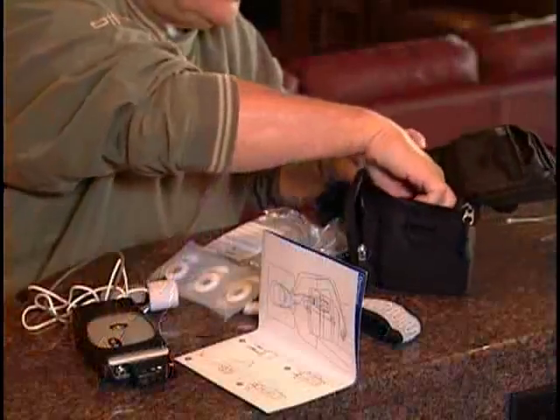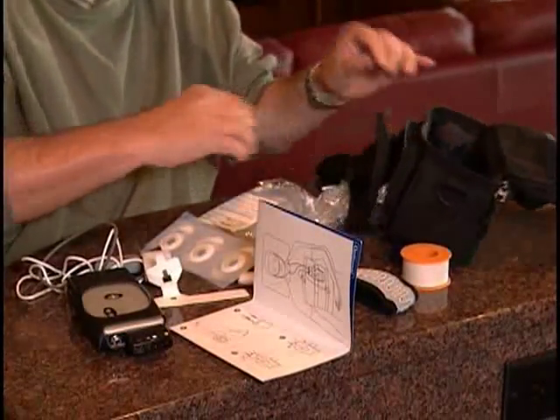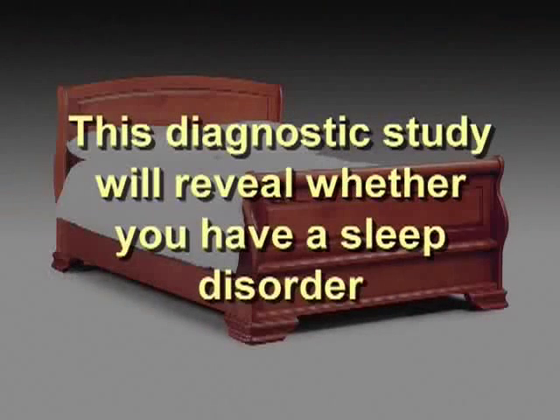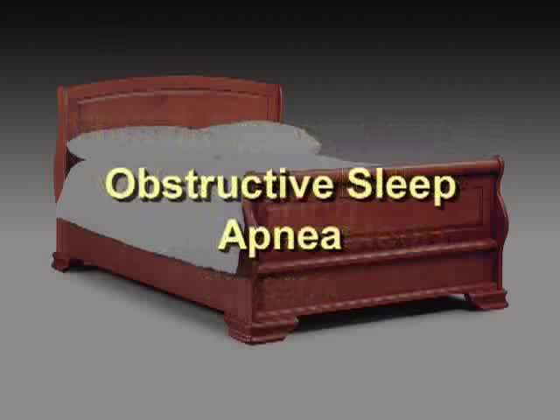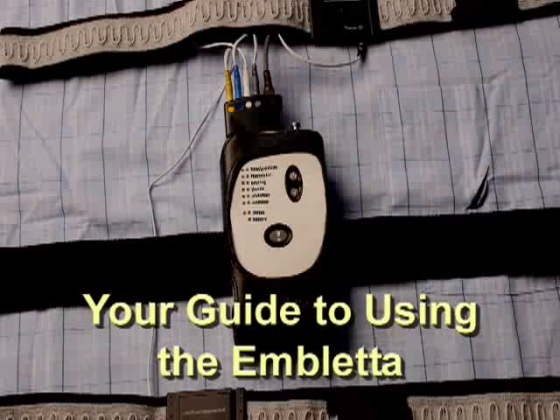It has been recommended that you have a study to monitor the way you breathe while you sleep. The Embletta recording device allows you to undergo a sleep study in the comfort of your own home. This diagnostic study will reveal whether you have a sleep disorder. The most common types of sleep disorders are obstructive sleep apnea and snoring. This video will show you how to hook yourself up to the Embletta in your home.